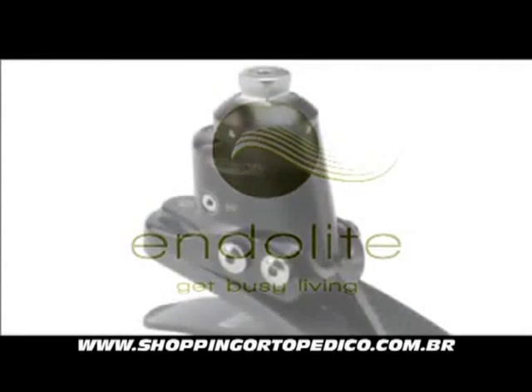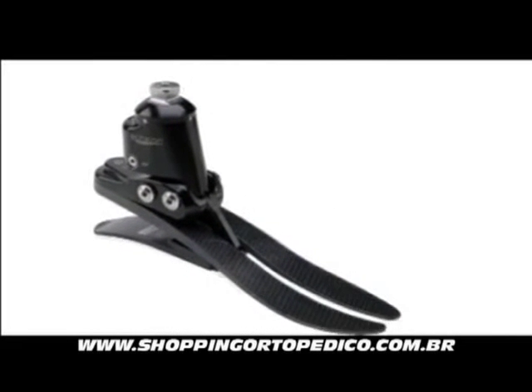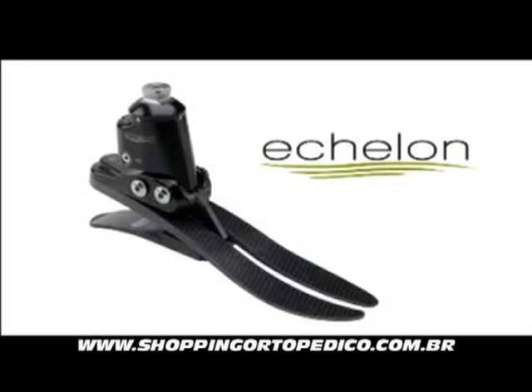From Endolite, a breakthrough in prosthetic design and philosophy. The Echelon prosthetic foot has been developed by Blatchford, the world's most experienced manufacturer in prosthetics.